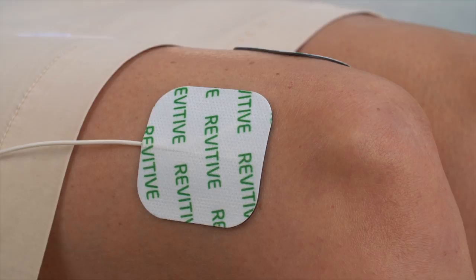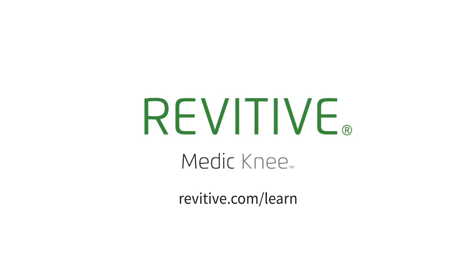As you can see, using the Knee Program and TENS Program on the Medic Knee device is very easy. For more help on this and other topics, please visit revitive.com/learn.